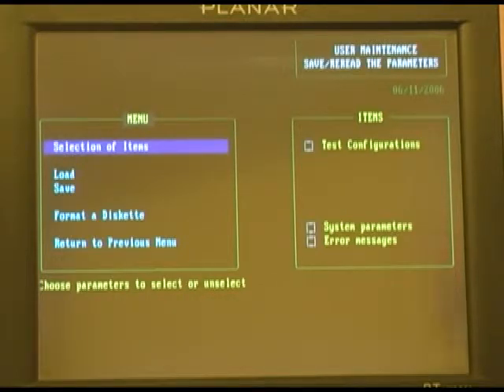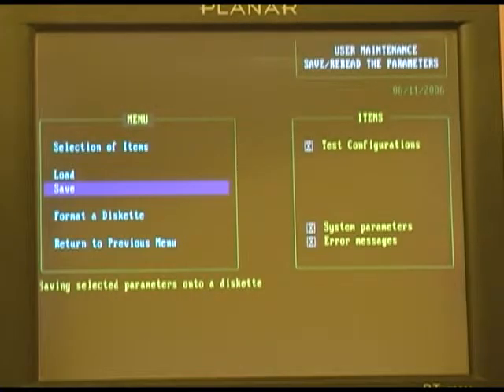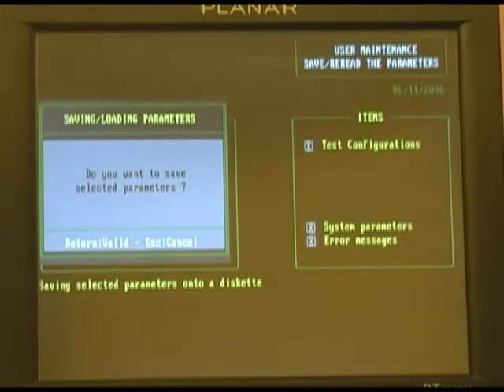All you would need to do is to highlight those things you wish to save. You need only to hit the space bar to highlight the variables you wish to save. Once you've made your selection, hit F10, select Save, place your formatted disk into the floppy drive, press Enter, and then return to validate.